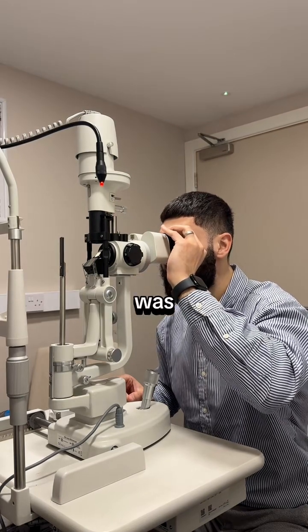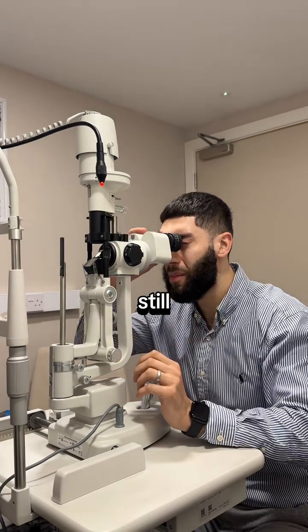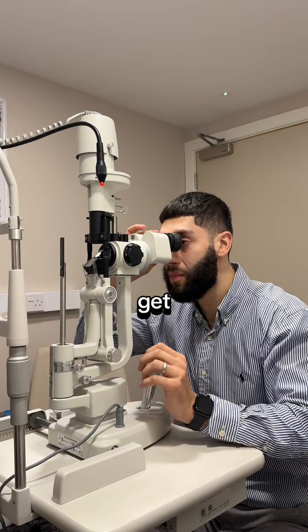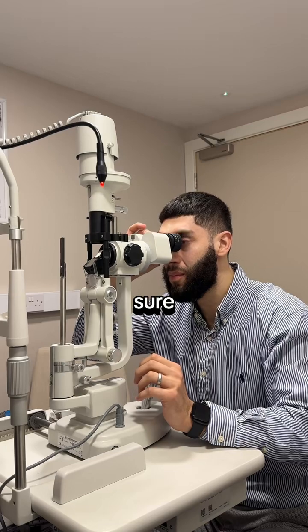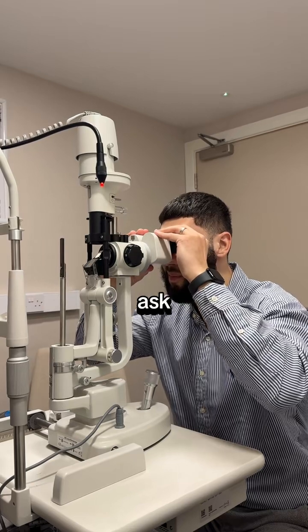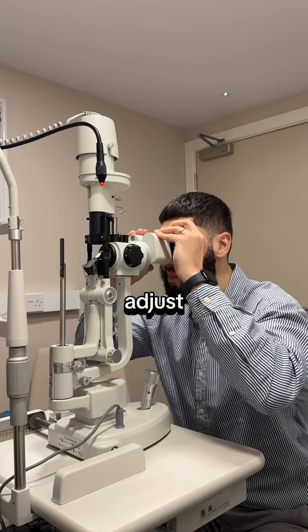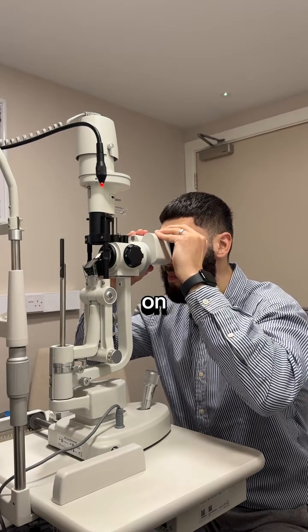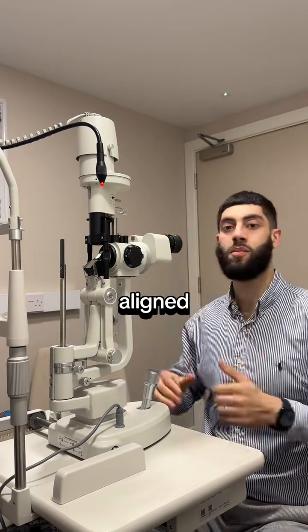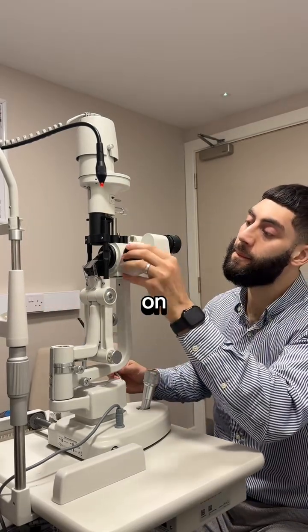I also wanted to demonstrate how to set the patient up on the slit lamp, but since I can't get a patient, here's a verbal description. Get your patient to pop their chin on the chin rest, making sure the table and chair are at the correct height. Ask the patient to place their forehead on the bar so they can rest it there. Then adjust the dial on the left-hand side until the marking on the right-hand side is aligned with the outer canthus. That is how you set up your patient on the slit lamp.